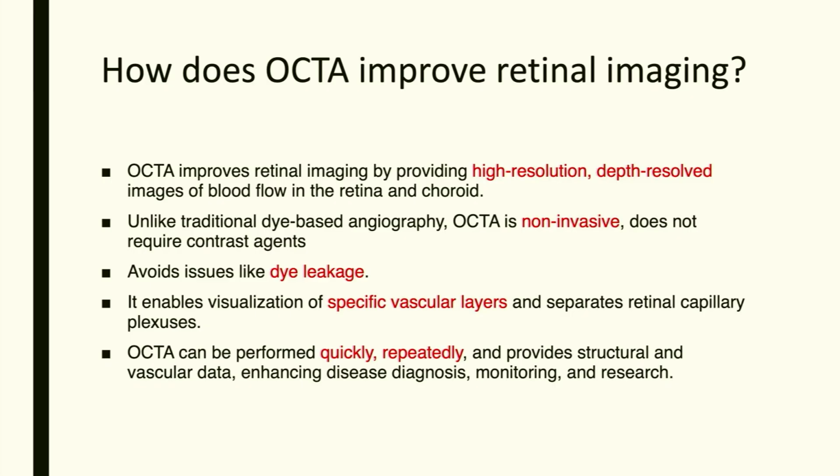No more question of anaphylactic reaction, keeping hydrocortisone, keeping anesthetic standby, asking for allergy, the patient will have vomiting, throw up, fasting, so many things. Here you can do it multiple times. I don't like this one, go and take another one. You couldn't have done that with a fluorescein angiogram. You can't repeat a fluorescein angiogram like that.